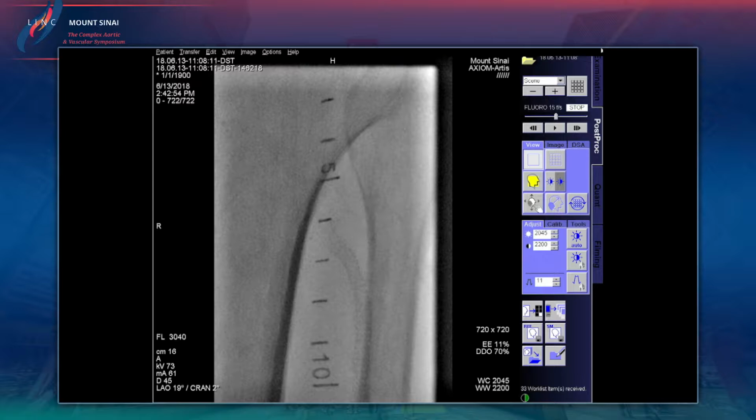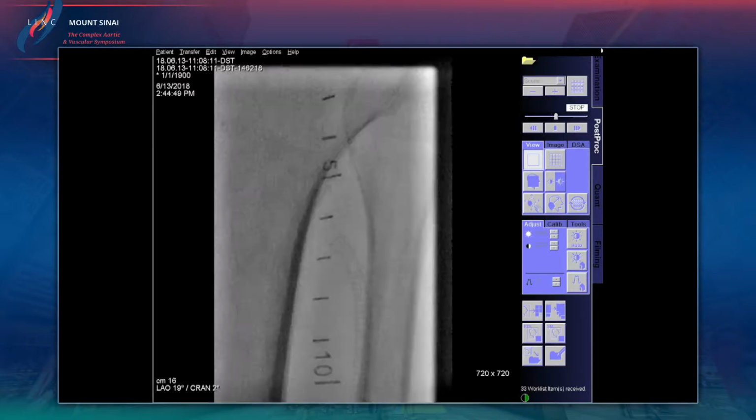PK, that wire is a little hard to shape. What I do, I can't see if that's what you were doing as well, I put it through a dilator of a sheath, and then I fold my finger over the top of it as I sort of strip the wire, so to speak. Is that what you do?